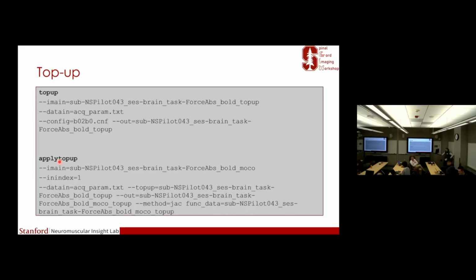Something which came up yesterday also. It's built in.